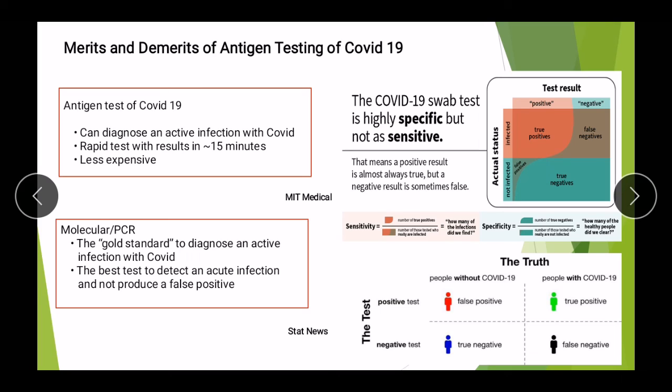Because sensitivity is low, the number of false negatives is very high. These are the people who are actually infected with COVID-19, but even though they are infected, the test shows a negative result. Hence, it is called a false negative.